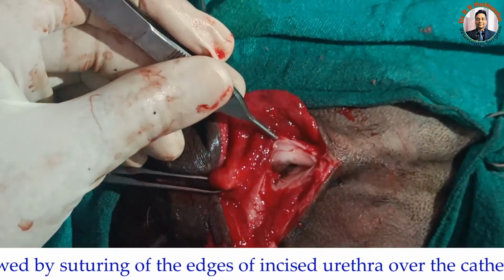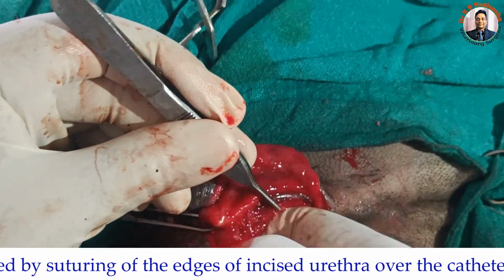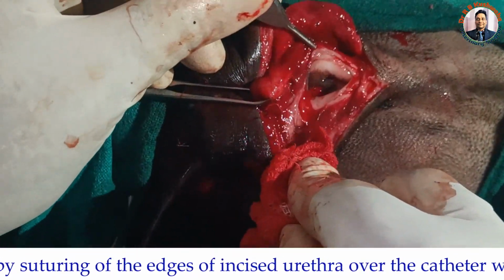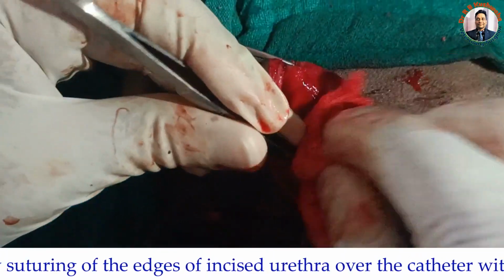Now you could see that this is the mucosa which is opening outside. It means here it is almost at the glans penis level.